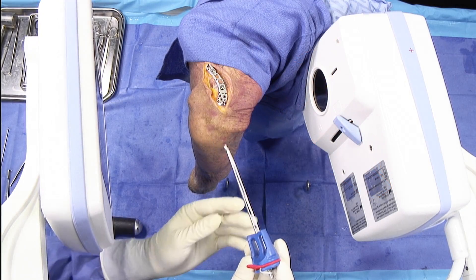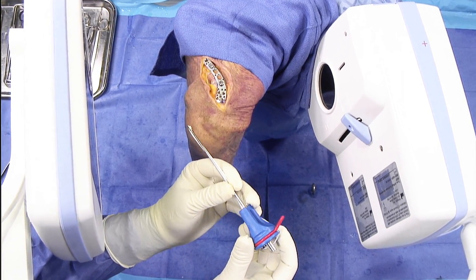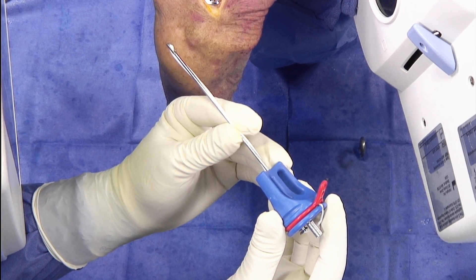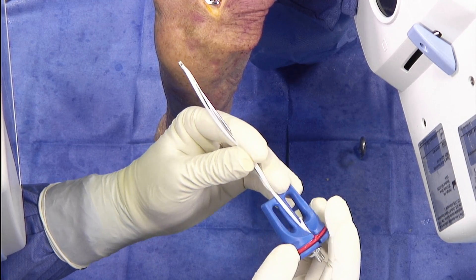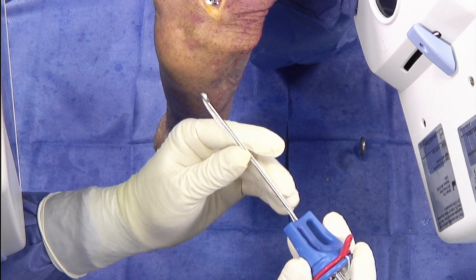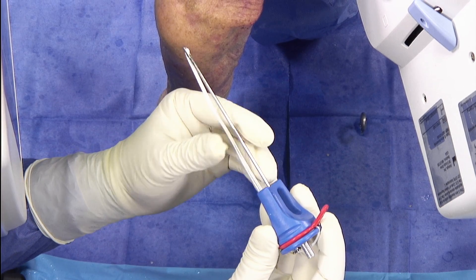Today we're going to talk about a new device, the Nautilus clavicle plate tightrope. We've had this developed more for the trauma surgeons and the guys who are dealing with 2B fractures that don't want to get involved with arthroscopy of the shoulder to pass their devices. This makes it quick and simple, based off a trauma approach, kind of like the old Bosworth screw, but with a modern-day sports medicine take on it.